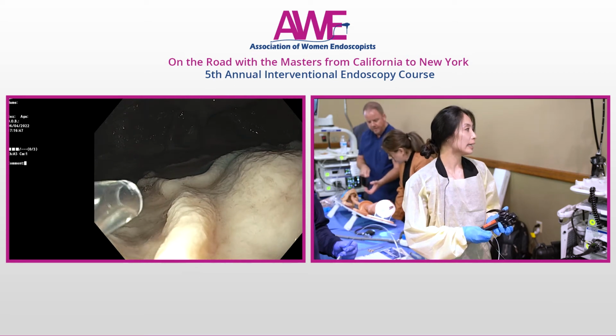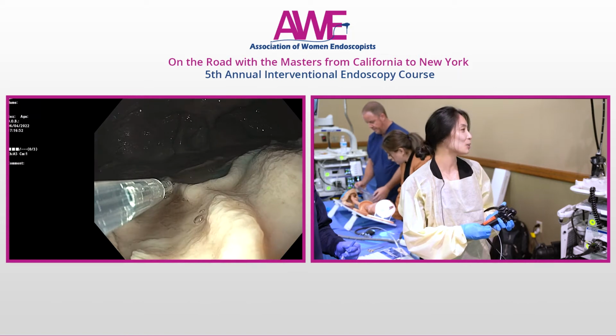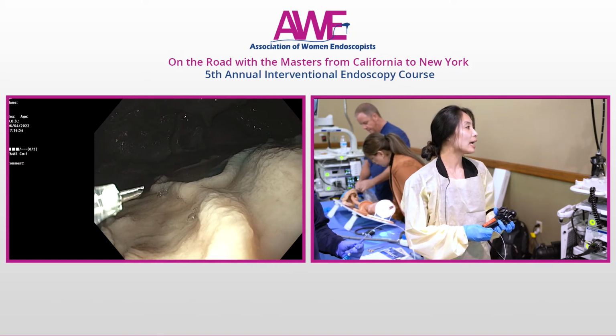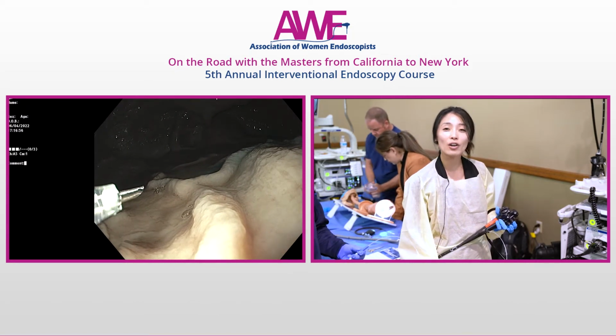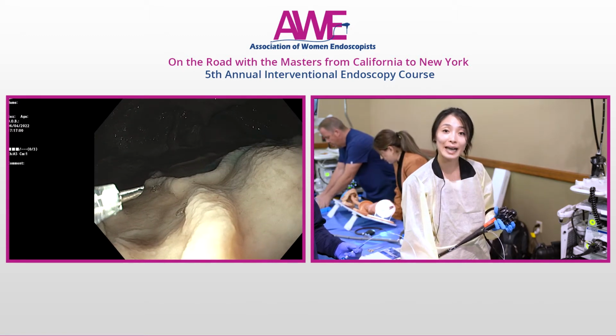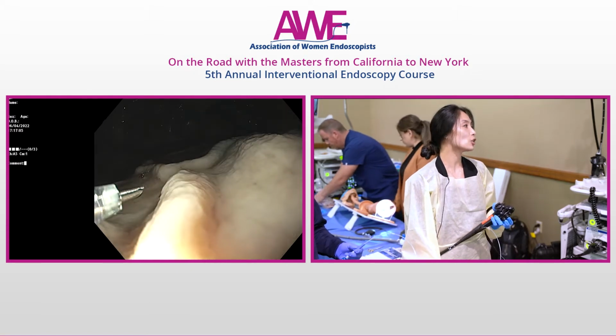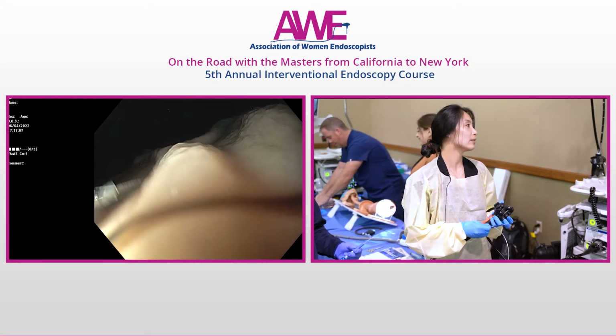So we have the needle in at the moment, and I'm going to ask my very experienced assistant to put the needle out. And what we try to do is we try not to inject into the lesion itself. You can definitely inject into the lesion if it's a very benign lesion. You can go right into the center and it can save you some time. But it's good to try to inject outside of the lesion itself.